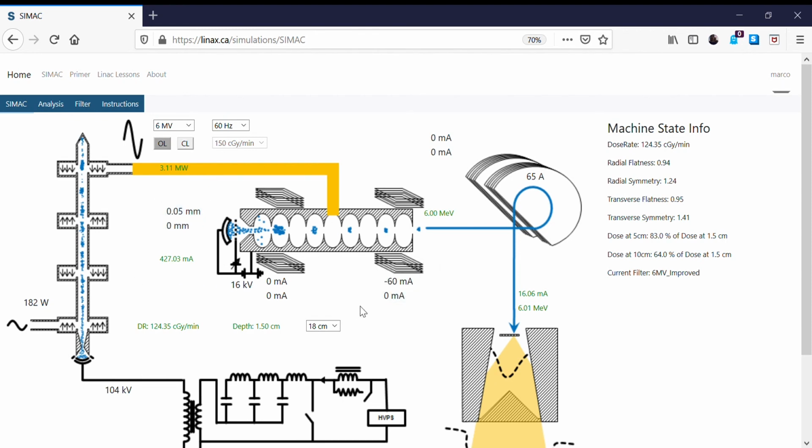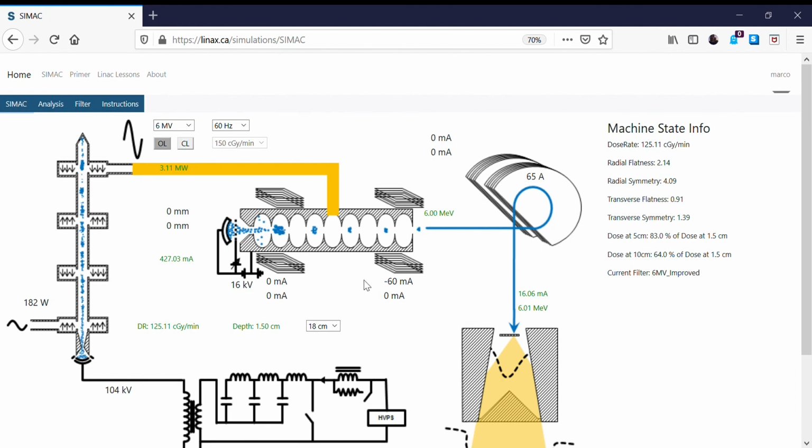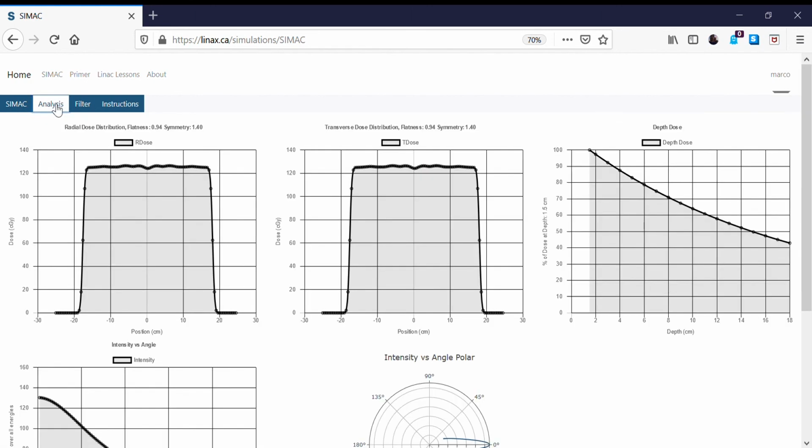Now, just to see the effect, let's see what would happen if we had no beam error, but we still had a radial steering current applied. I can decrease the gun error back to 0 and remove it, and then we can have a look to see what happens with the beam in that case. Now our beam on the analysis tab is showing that it's asymmetric again. It's higher on the left side than it is on the right side, which is what you'd expect. We correct that by removing the radial coil current, and we now have our flat beam again.